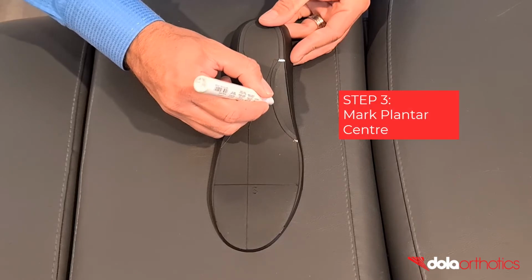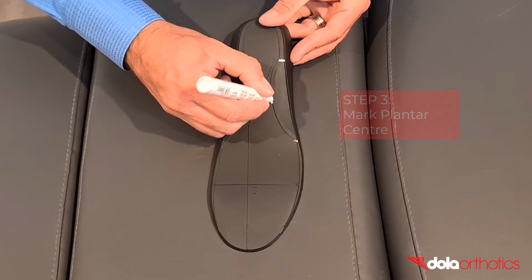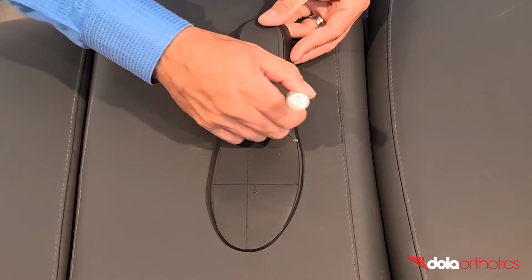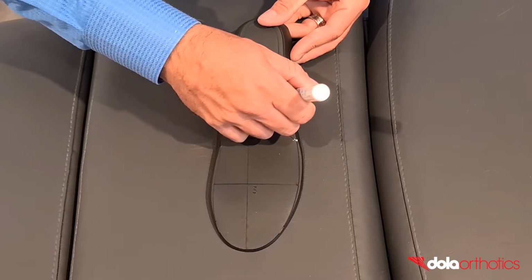Step 3. Mark the plantar center point of the grind. This point determines the shape or aggressiveness of the grind of the plantar surface. This point can be customized for shoe fit or reduction in control.